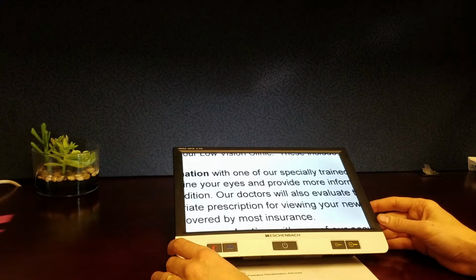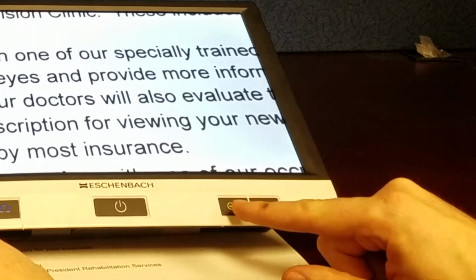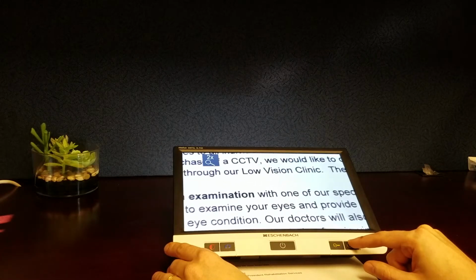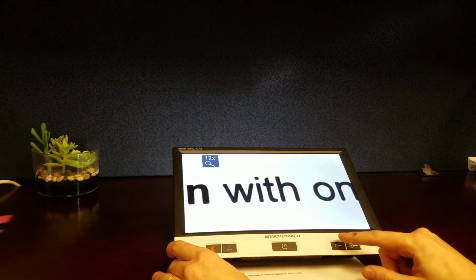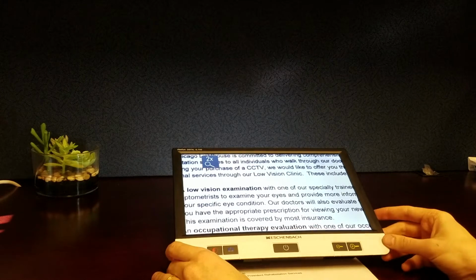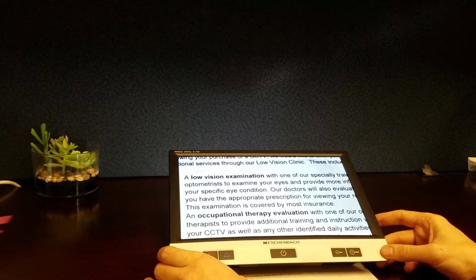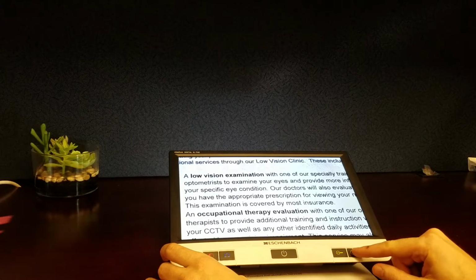Now we can control the magnification by using the magnification controls on the front surface to the right. So I'm going to go ahead and hit the smaller button and it will zoom out, hit the larger button and it will zoom in all the way up, and we can get it nice and large on there. And obviously the smaller we have it, the more text we will fit on the screen. So we get a lot of text on the screen at 2 times magnification, and so if we can read at that magnification, then that's going to work really, really well. So that's the magnification controls.